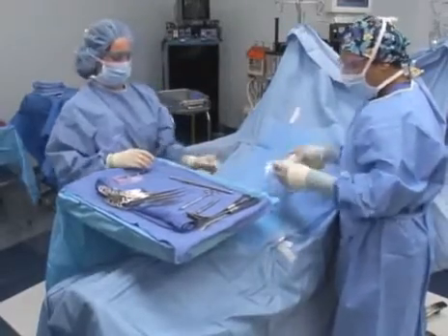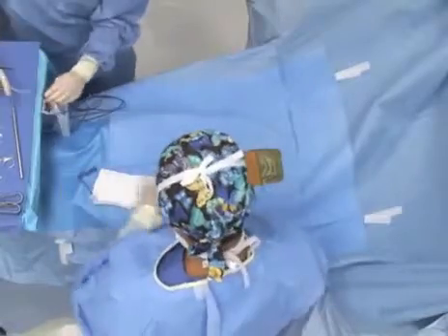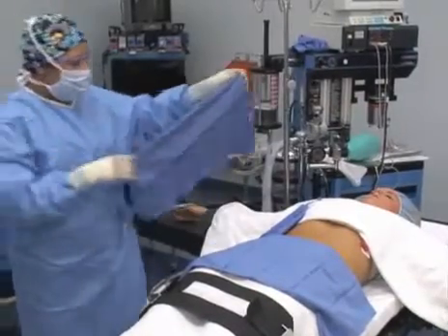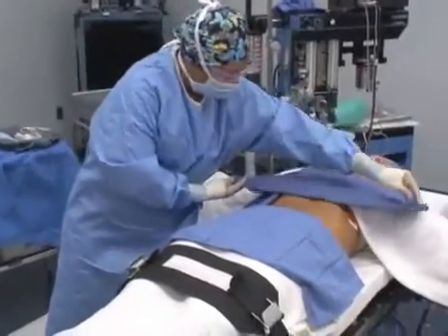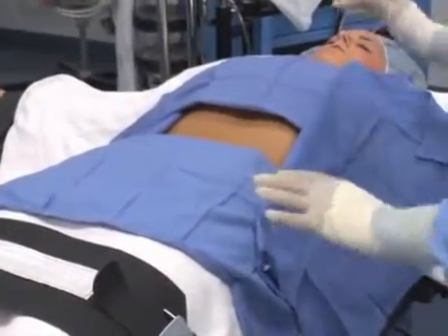After a drape has been placed, any portion that falls below the edge of the operating table is considered contaminated. If an area of the drape is suspected of being contaminated, the area may be covered with another impervious drape. After a drape has been placed, the edges are considered non-sterile. Do not reach over the prepped surgical site to place a towel or drape. Instead, move around the table to position yourself.